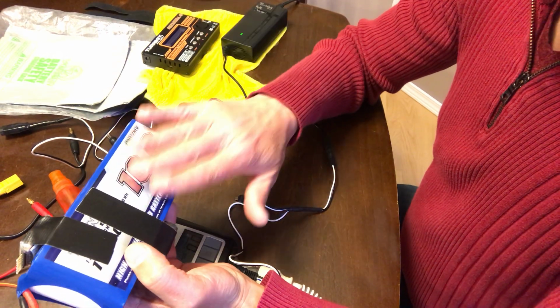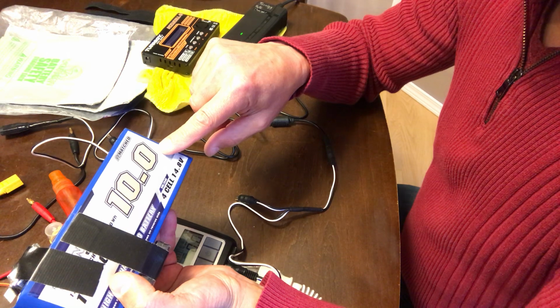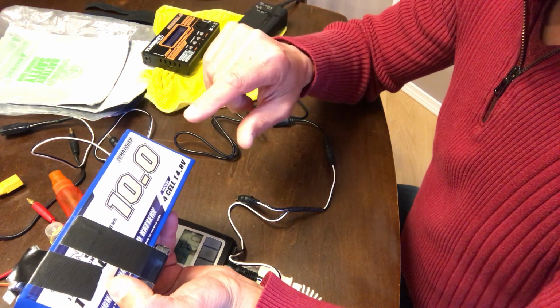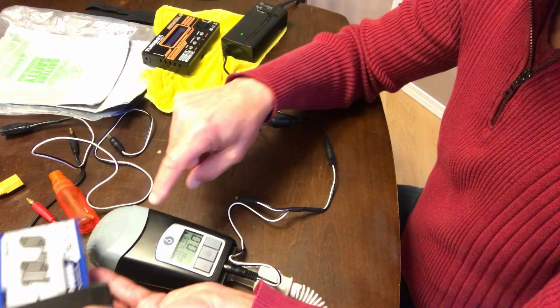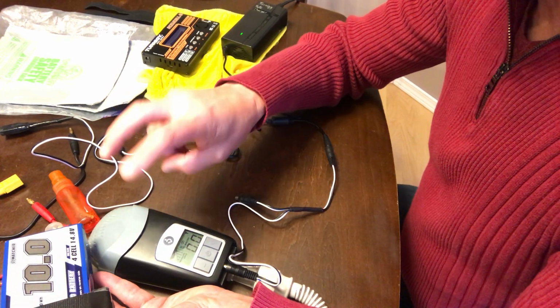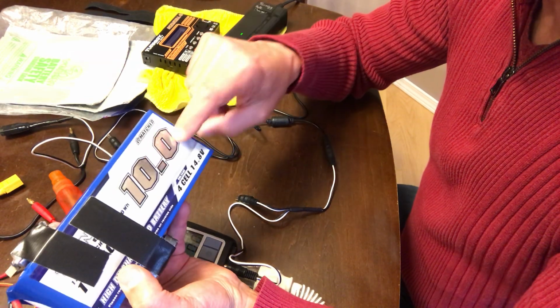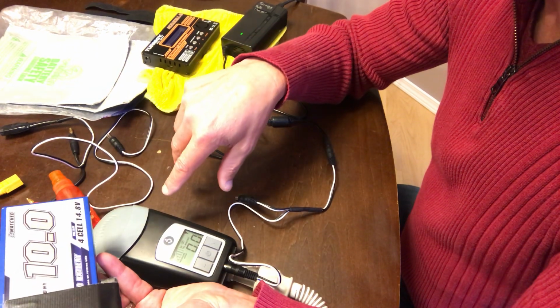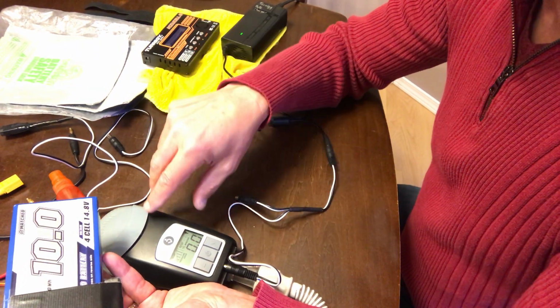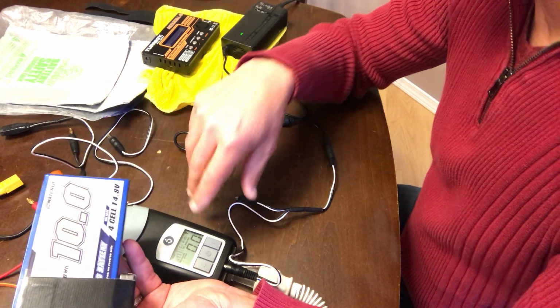But so this battery I found on Hobby King for $88, and it's a 10 amp hour, and that is amazing because if you go to buy the medical device battery for this unit, it's like $500 for half of the power. So you'd be $1,000 to get this kind of wattage. It was just insane because it's a medical device, and I don't know. It's very, very frustrating that that's the medical industry we live in.